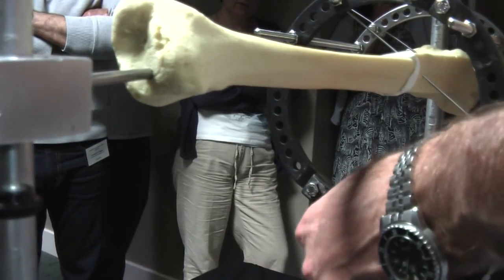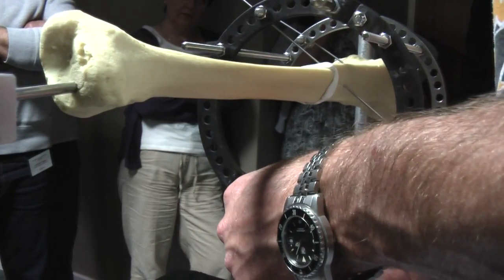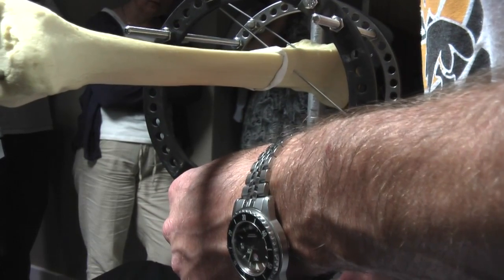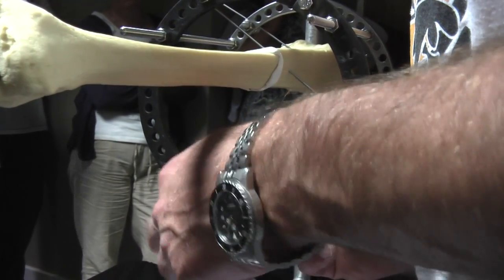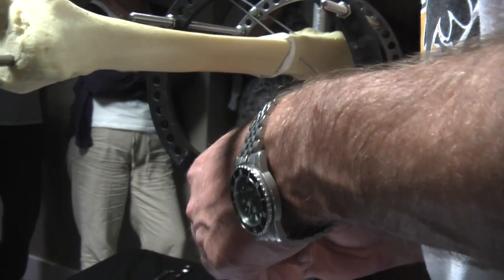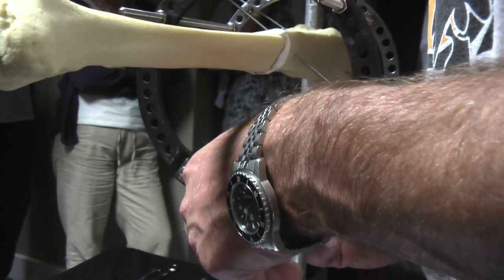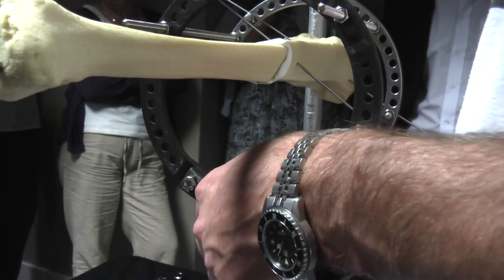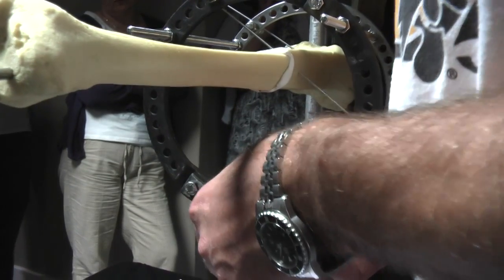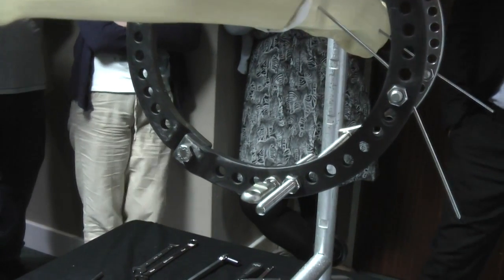And obviously, if you do this with the intensifier, you can actually see the second hinge. You just see them superimposed, not as a double shadow. But there we go. I think that's about there. And so far, we've done nothing but stick two wires into this leg. So we've done nothing so far we can't walk away from.